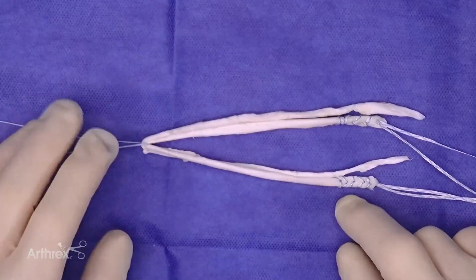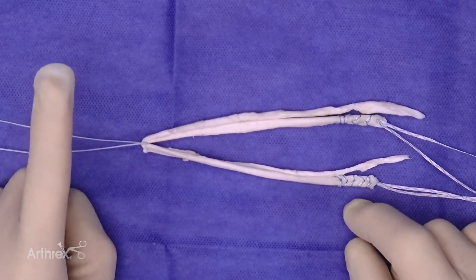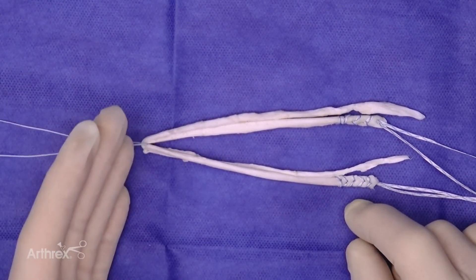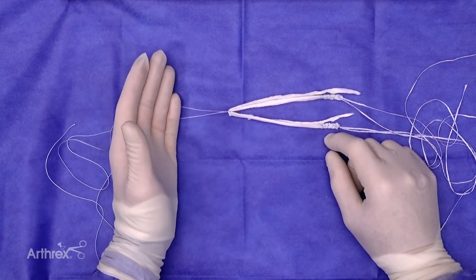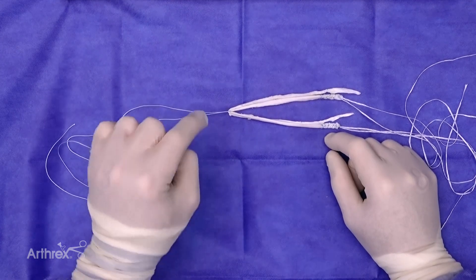The options at this point are twofold. Either a hybrid technique can be utilized with hamstring allograft, or alternatively, one of the two grafts can be tripled in nature. That has two benefits: it is cost-effective, as you do not need to use allograft tissue, and therefore the cost savings to the patient and potential hospital system go down.